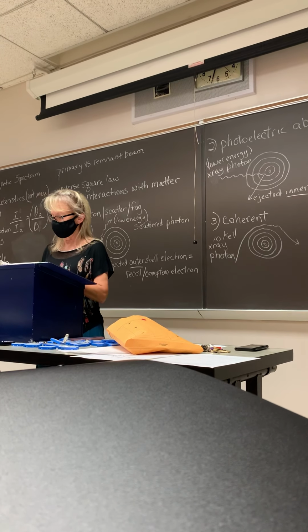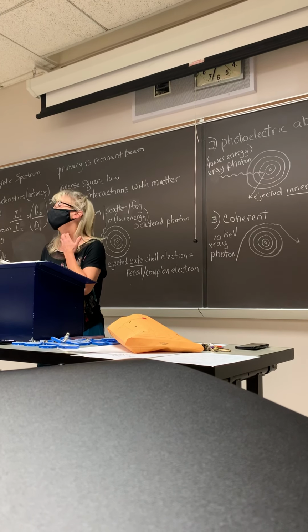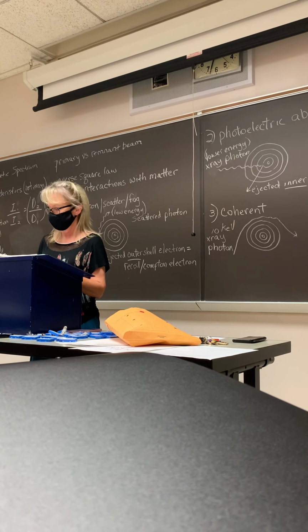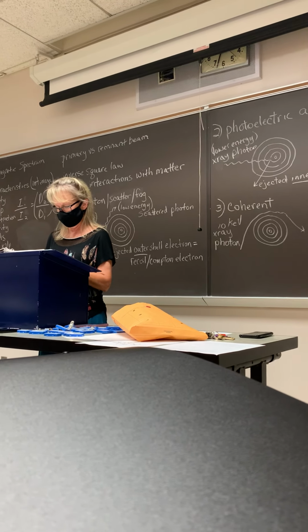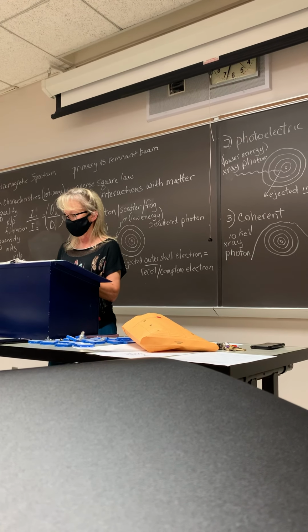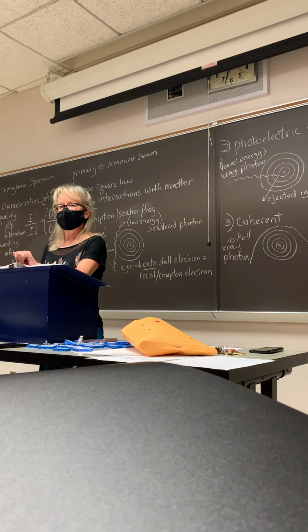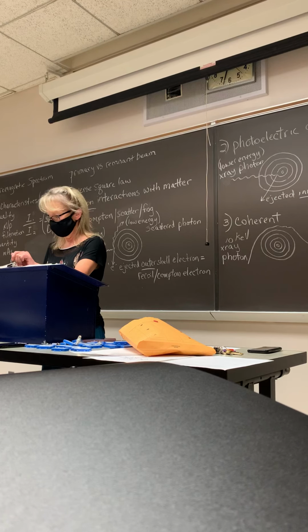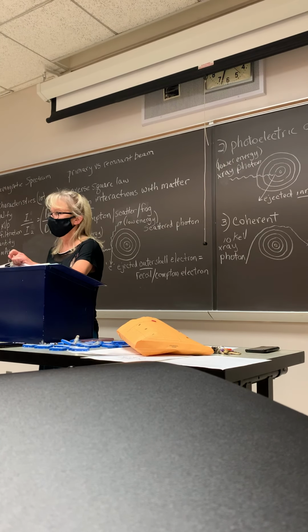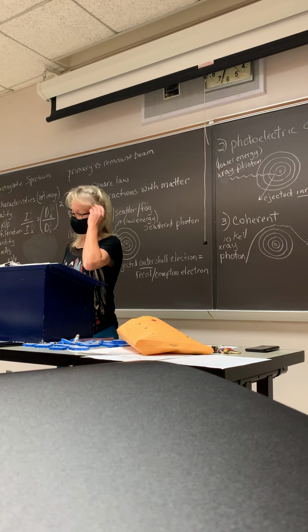Okay, source to skin distance. Okay, for mobile units, there's more numbers you need to know. For mobile units, the minimum is 12 inches from source to skin. 12 inches for mobile units. You can't get any closer than that. For stationary units, you can't get any closer than 15 inches source to skin distance. They're a little bit higher intensity.